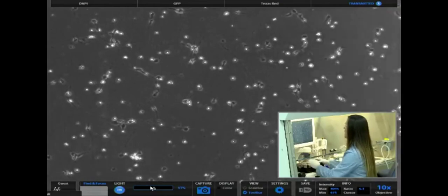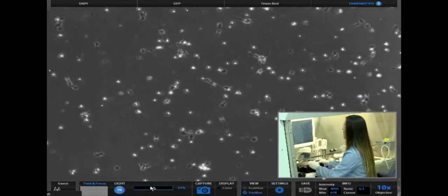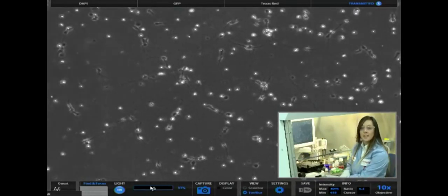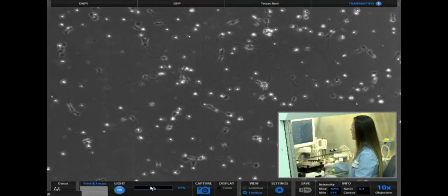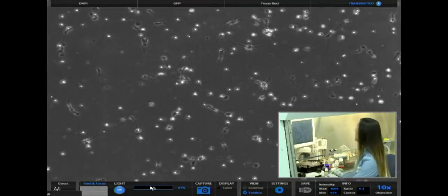So these are our day 10 neurons in B27 and Culture 1 media, and then at day 5 we transferred over to B27 Plus. So 5 days in B27, 5 days in B27 Plus. You guys can see that it's a nice monolayer, there's minimal cell clumping. You also see very elongated axons, and they're very connected. It's a nice culture, especially for imaging purposes.